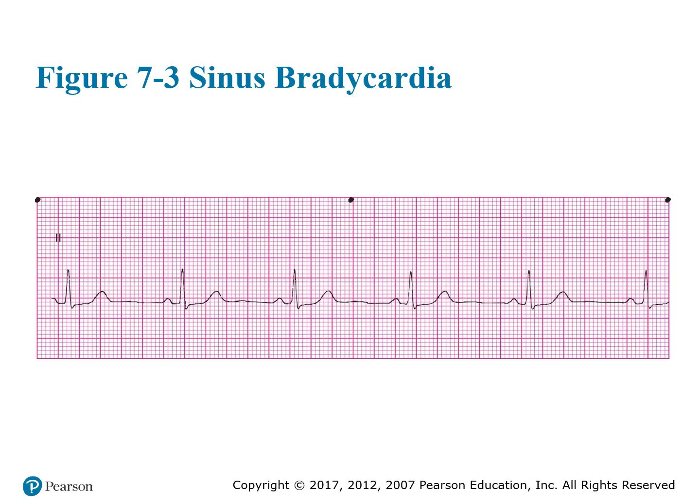Here's a typical rhythm of a sinus bradycardic patient. We have a rate of 1, 2, 3, 4, 5. I have a rate of 6 here, but if you count this last little guy, he's right at the end, so you don't get the full one in there. So technically, he's probably like a rate of 58 or 56 or something like that.